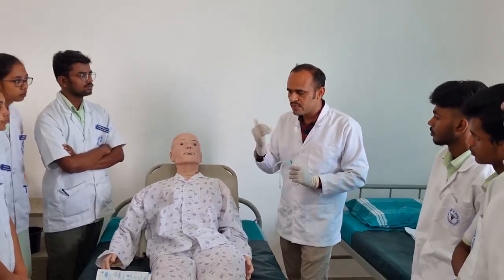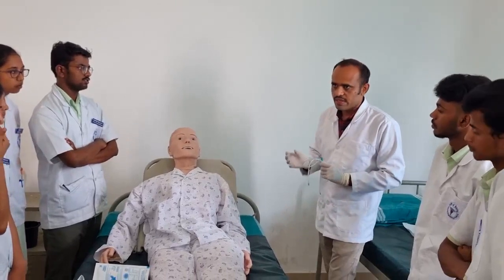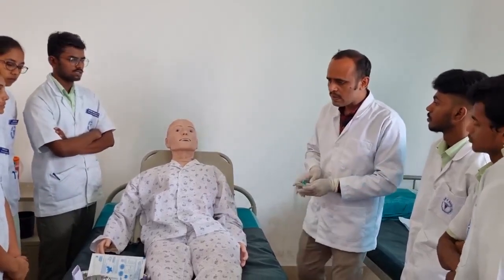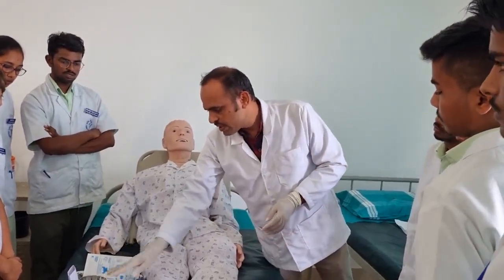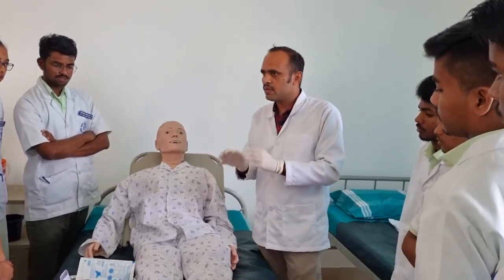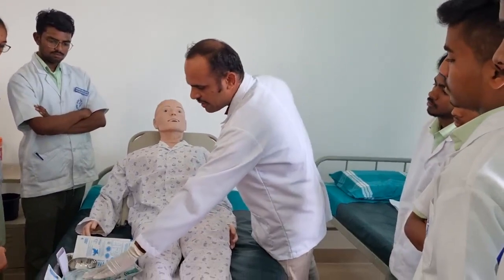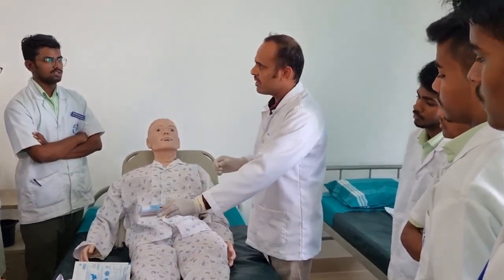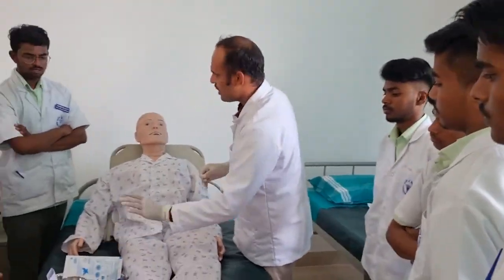Okay, next let's see the procedure regarding NG tube insertion, that is gastric feeding. Regarding gastric feeding, there are different sizes of NG tubes. So what are the instruments needed, the things needed to do the procedure? One is the NG tube, and then the lubricant. The lubricant is essential to insert the NG tube, and next, a paper bag is needed.